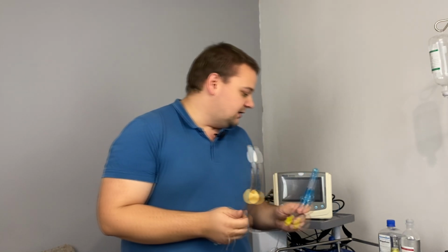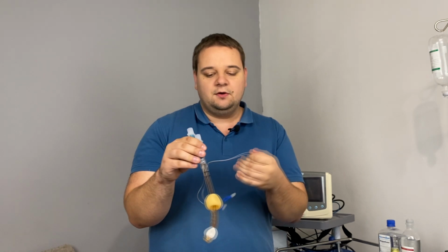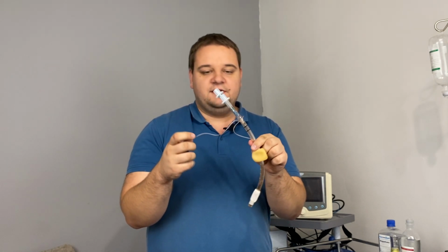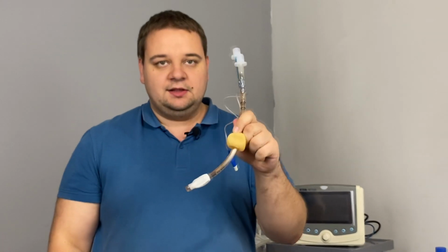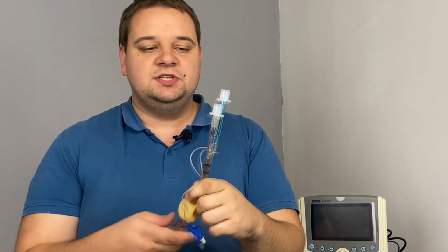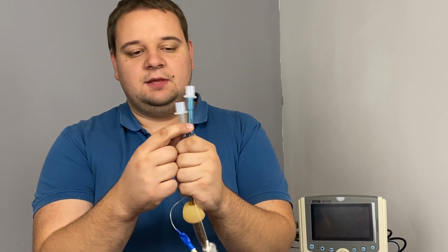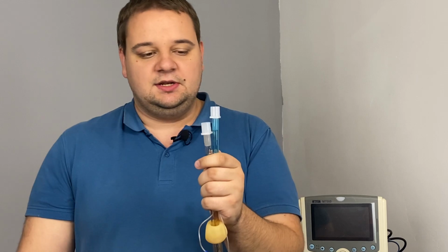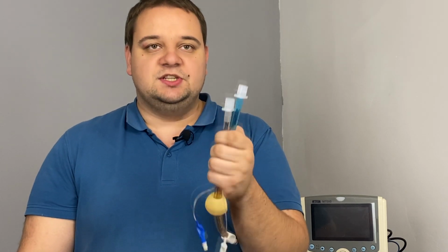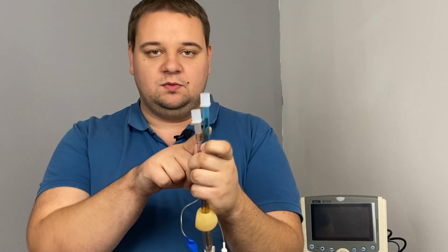For those lucky men, they have invented an additional tube. This is called the Combi tube, or the combined endotracheal esophageal tube. With this one, you also use it blindly, push it inside the patient, and you see that it has 2 entryways. Number 1 is blue, number 2 is white. Blue is usually associated with oxygen in case of emergency medicine. So in this case, we suggest that by default, we will ventilate the patient in number 1.